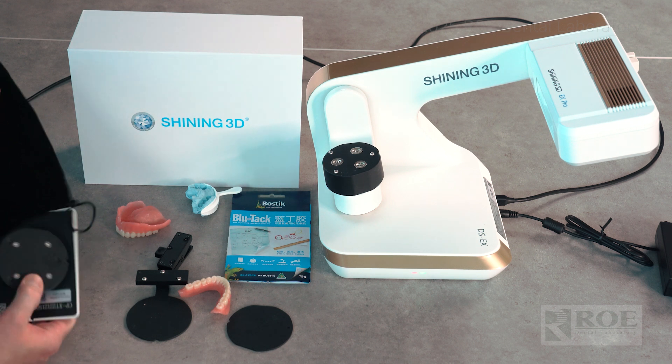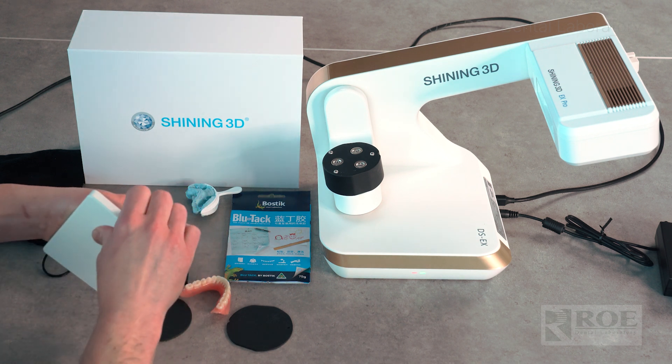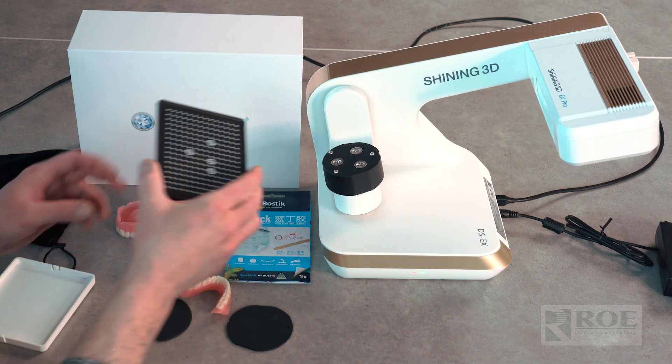We're going to calibrate the device first because we did move it. Anytime you move your scanner, you want to make sure everything is calibrated. First, take off this plastic plate without touching the surface, because light reflects off of that — it's very important you do not touch it.